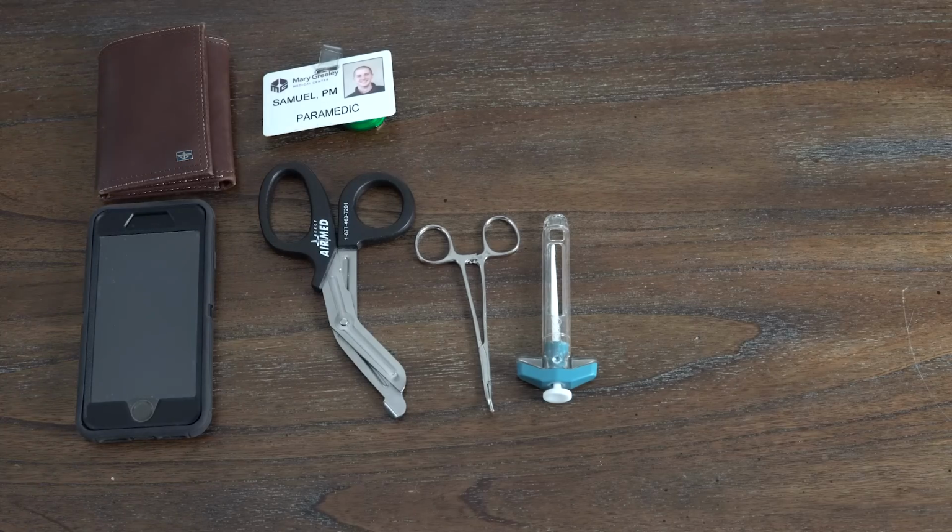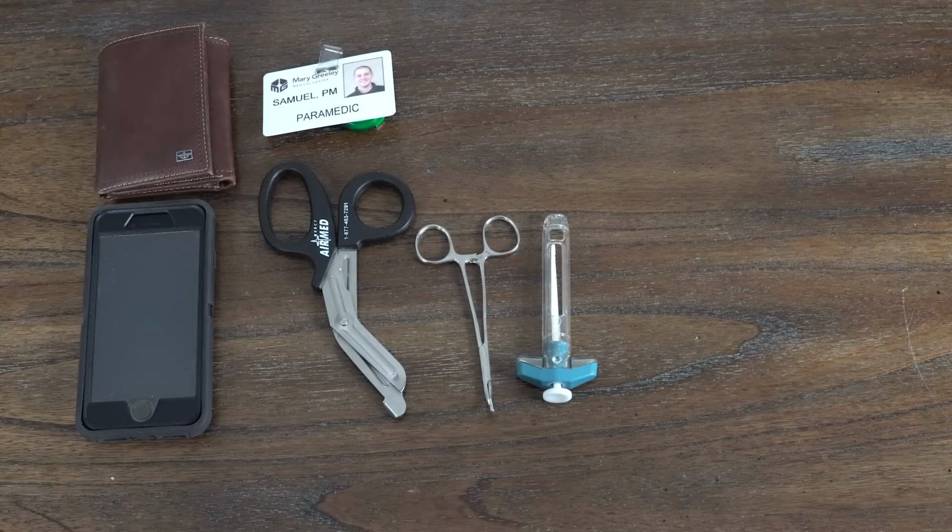But you can also use them to clamp the air hosing to a BP cuff, so you can inflate the BP cuff, use it as, say, a tourniquet, and this keeps the air from leaking. Or you can wrap the BP cuff around a bag of saline and turn it into an improvised pressure bag for if you're infusing something rapidly or if you're pushing something into an IO.